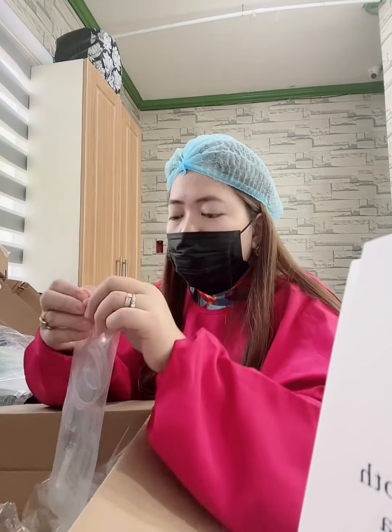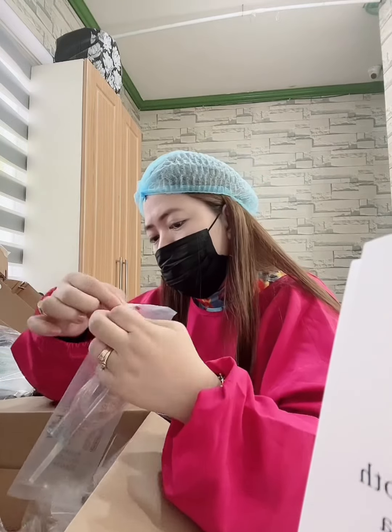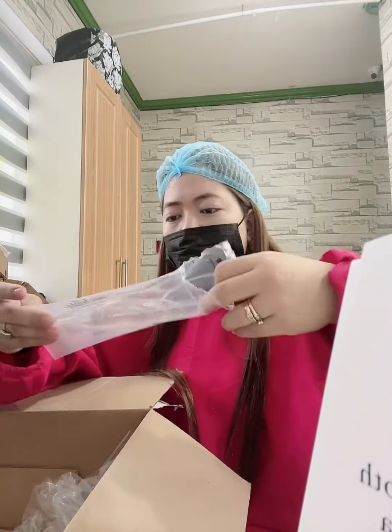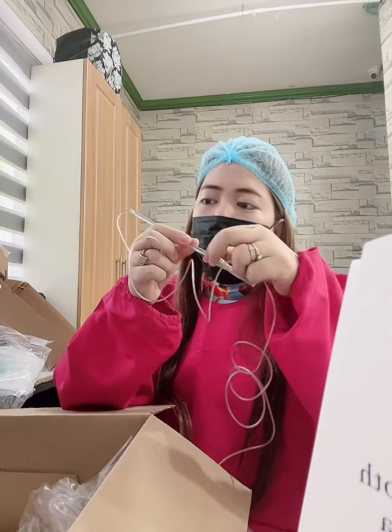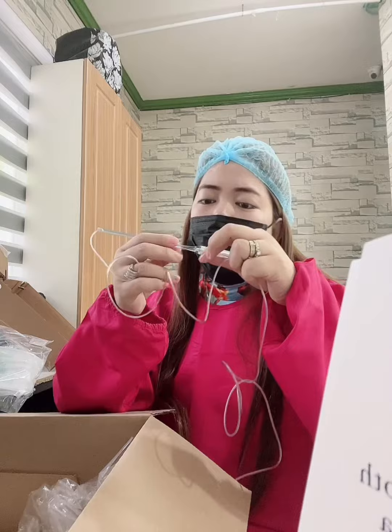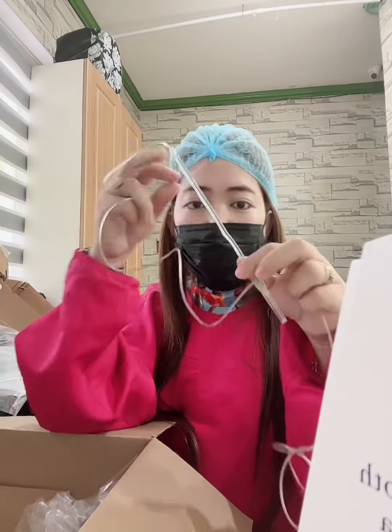The pen. How do you open it? So this is the pen, guys. And you can bend the tip to make it handier during insertion. You can bend it from here to here, down here. And then this is the holder for the cartridge. Attention, consult manual before operating.